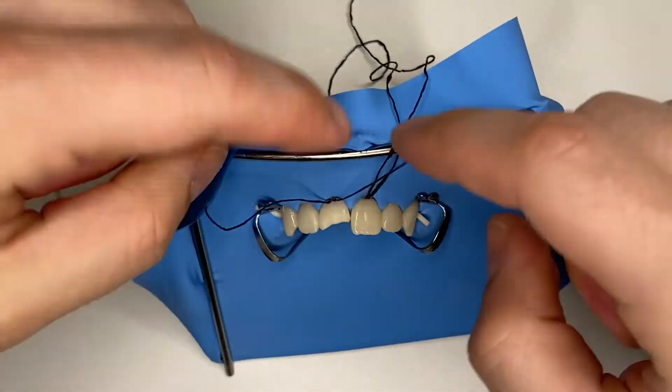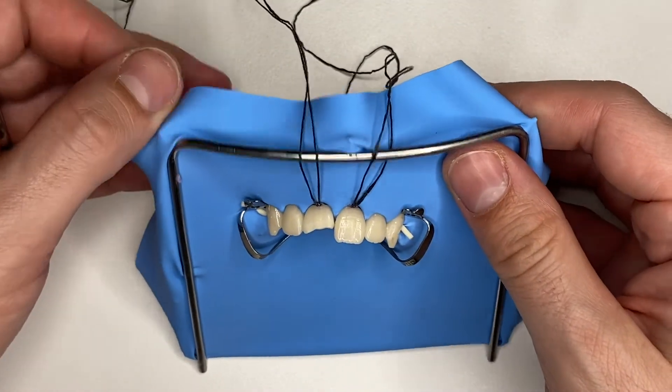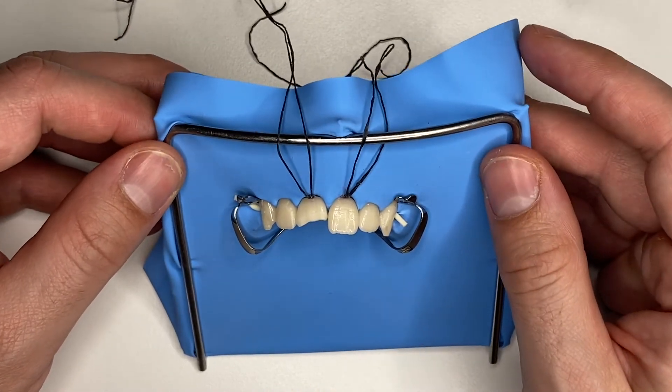That's number two. This setup is going to help if you're going to bond two veneers on the centrals, and you can take it even further and go all the way to the canines.